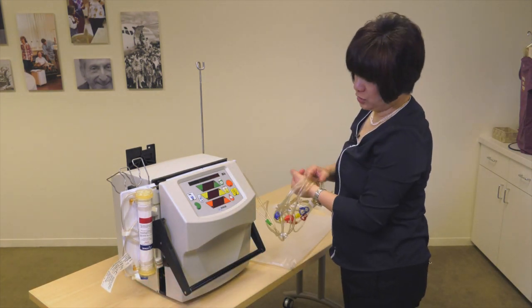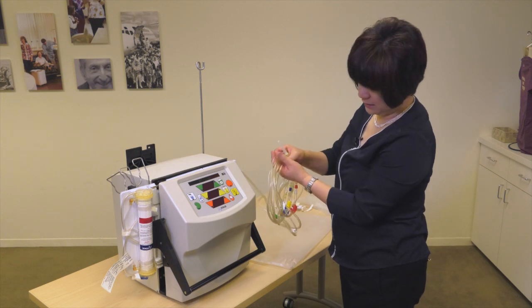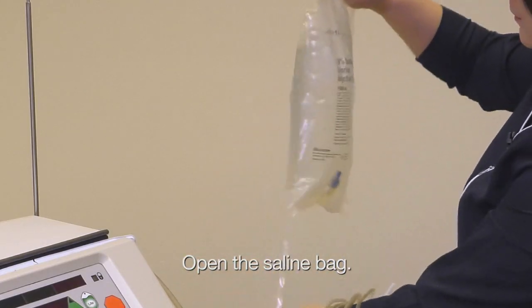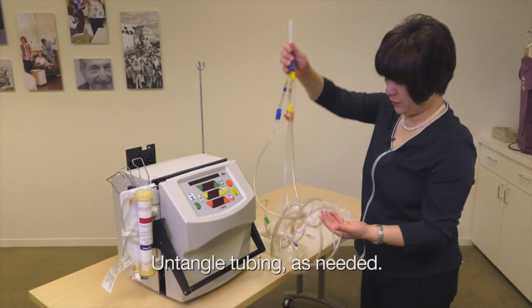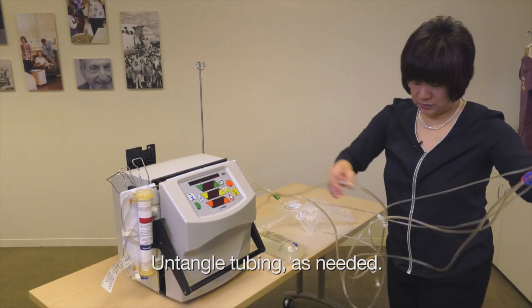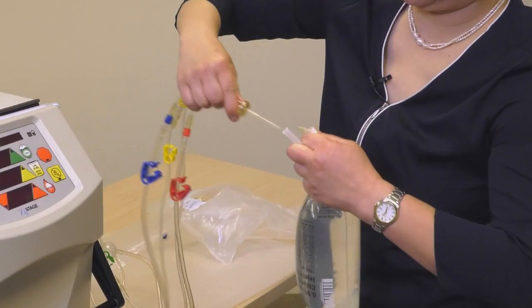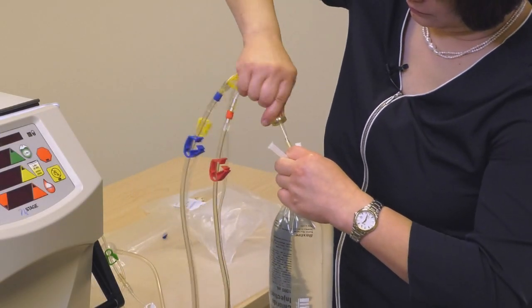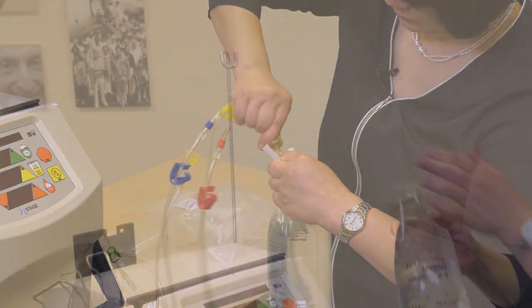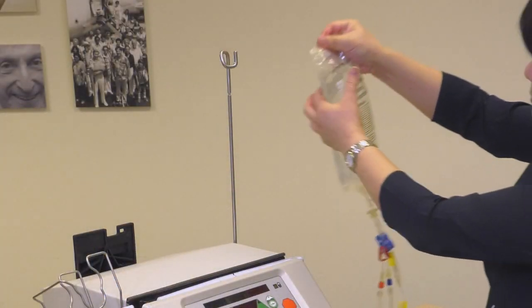The next thing is we're going to spike the saline. So I'm going to open up the bag of saline. I'm going to free up the tubing, untangle it a little bit. And then we hang the saline back up here.